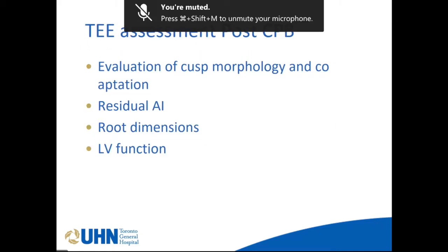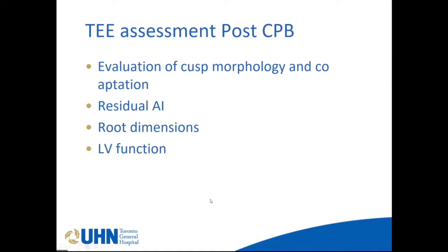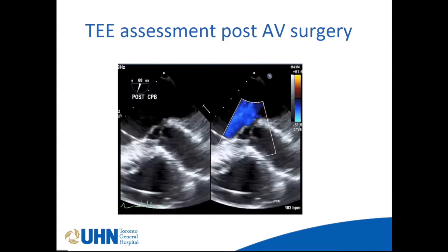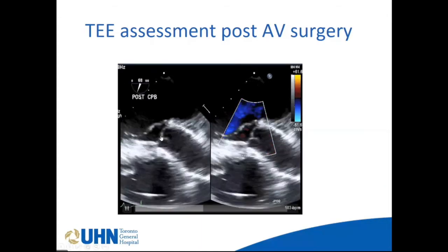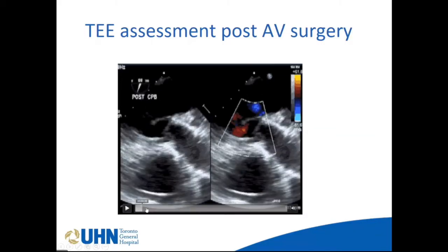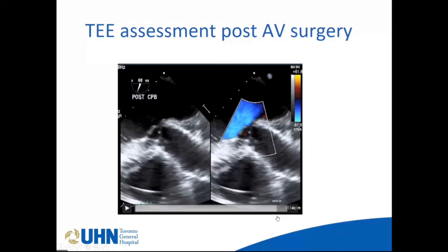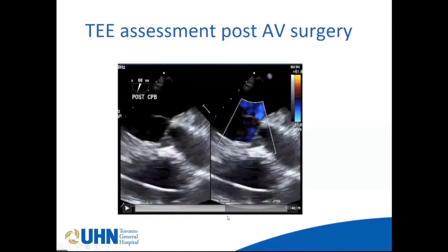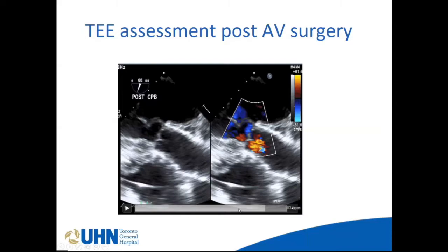Post-CPB assessment after aortic valve repair surgery: number one, evaluation of cusp morphology and coaptation; number two, residual AI; number three, root dimensions; number four, LV function — because the coronary buttons are reimplanted into the graft. The cusp coaptation looks nice, AI is minimal to none, and then we assess LV function. The important things to look for are the coaptation length and coaptation height, which I'll show in the next few minutes.